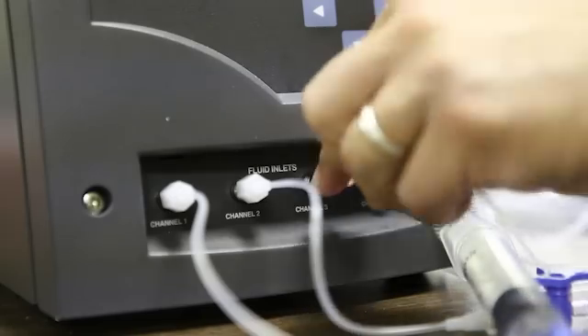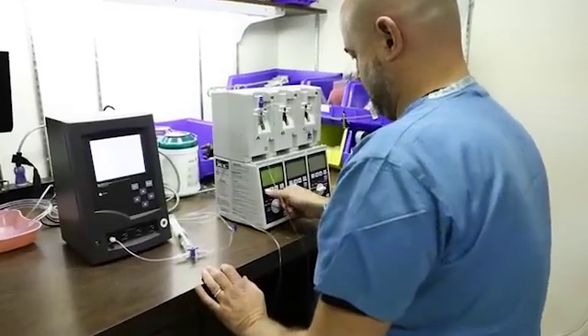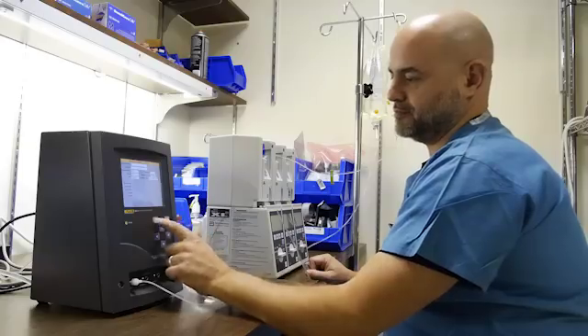You can hook up four pumps at the same time. The IDA5, it just does the job. I think people will be really surprised to find how much easier their job can be once they use it.